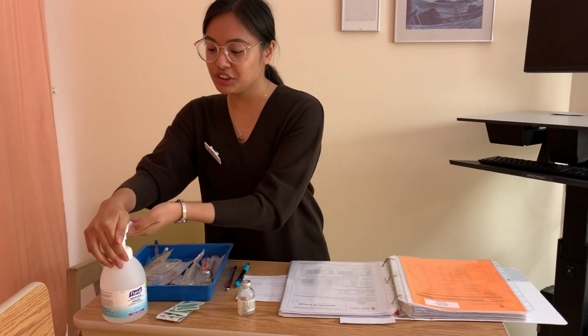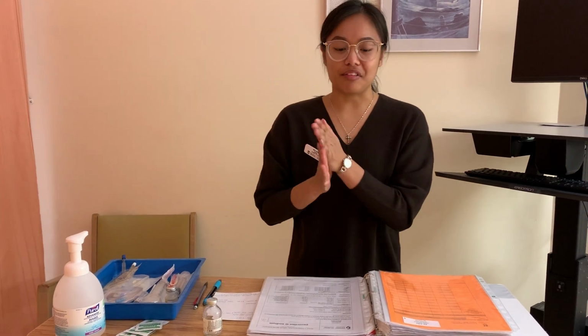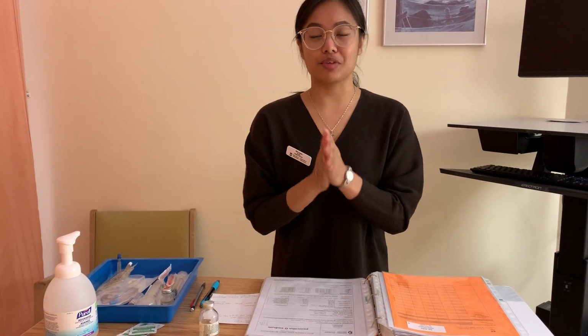Today I'm going to show you how to reconstitute, dilute, and administer an IV medication via the CIVA pump. First thing I need to do is do my hand hygiene, and I would have compared my physician's order with my MAR to ensure that the order has been transcribed properly.